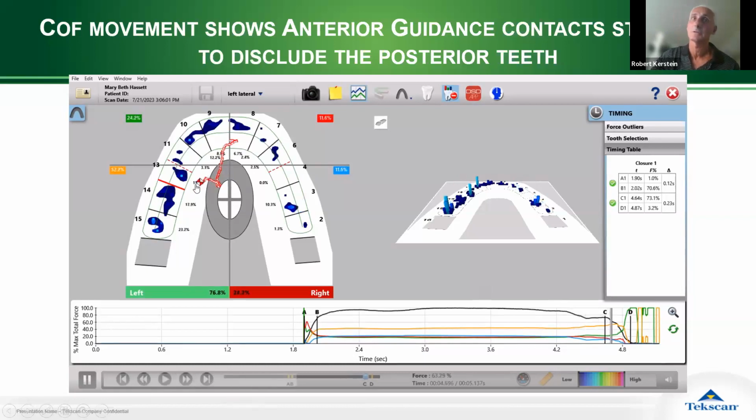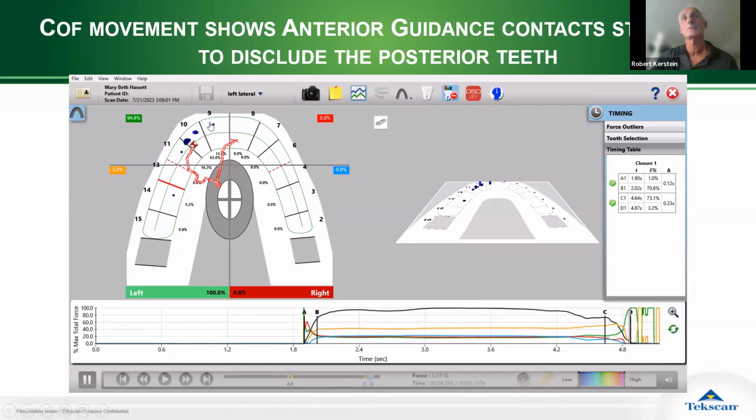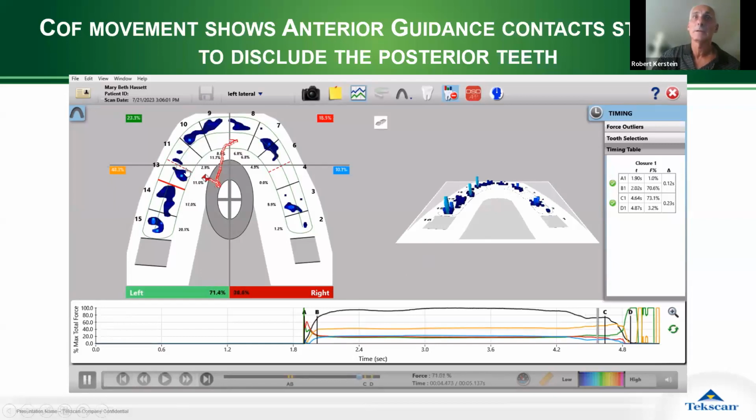See, it jogged posteriorly, right? Now it's jogging sideways. Now it's heading north like it's supposed to be, but then it goes sideways, and now it finally takes over and gets anterior. And those are the things, this area, the patient complains about their bite and they don't like the way their excursion feels. This is the piece of the movie that matters, right? What's happening here is being reflected in the teeth, right? And you see these columns fluctuating. This whole side is still involved, and the anterior guidance is working, and it finally takes over. And when it finally takes over, that's when this shoots up there.